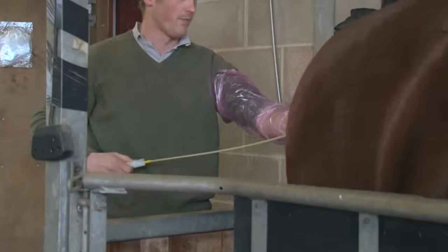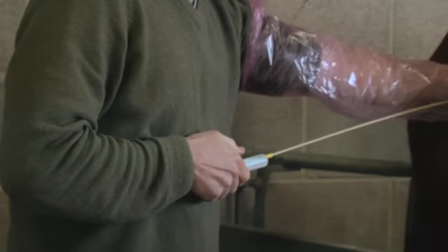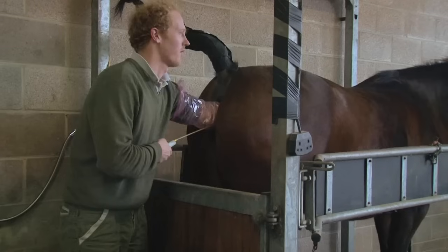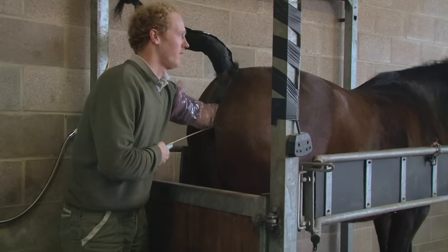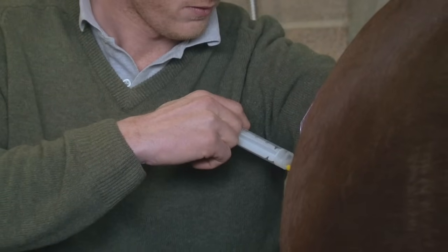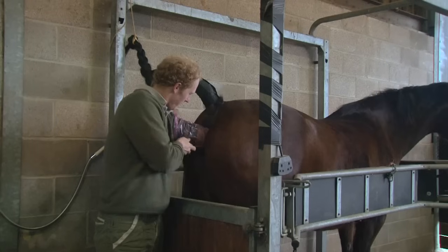The gloved hand and catheter are passed gradually into the vagina and over the pelvic brim. The cervix is then identified. Using the index finger, the catheter is then guided through the cervix and into the uterus, where the semen is then infused into the uterine body. The air in the syringe ensures the evacuation of all semen from the catheter.